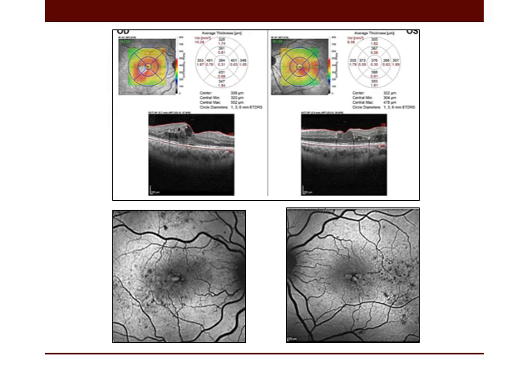Blue peak autofluorescence, or autofluorescence generally, can be applied in diabetic patients. However, it highlights only retinal changes if required. Other uses are not that marked.